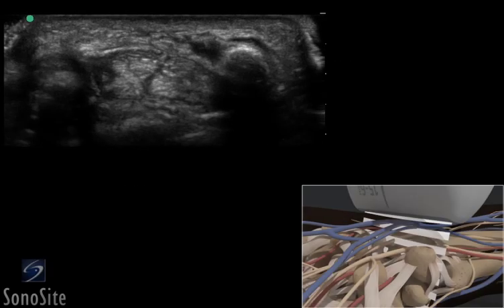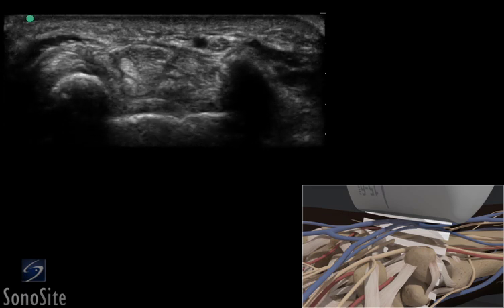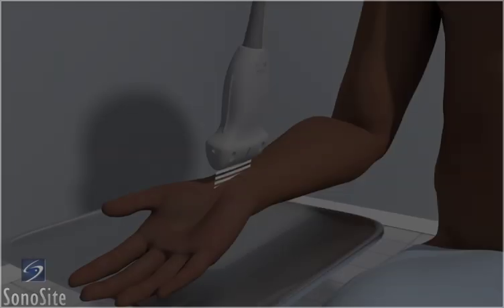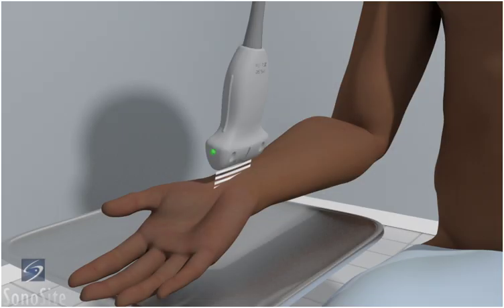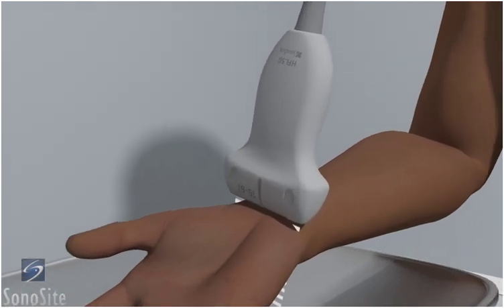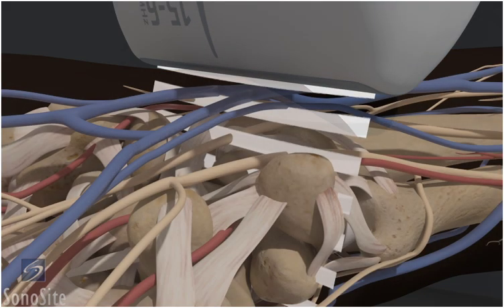A linear array transducer with a musculoskeletal exam type is used to perform an ultrasound examination of median nerve entrapment. The patient is in a sitting position with the arm flexed and the hand externally rotated. The transducer is placed transversely over the proximal wrist crease with the orientation marker directed to the patient's right.